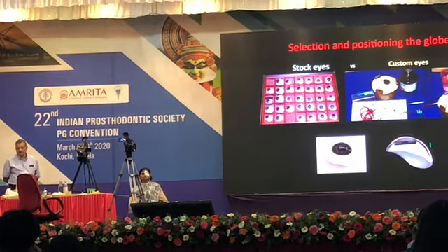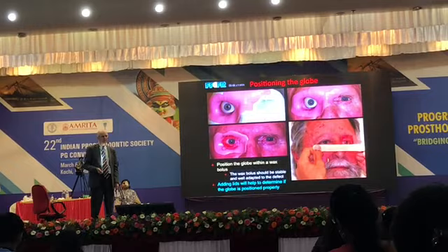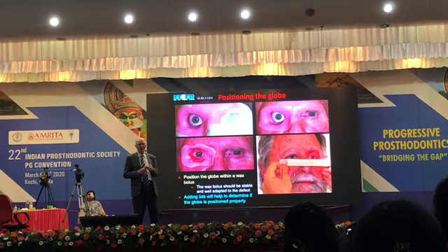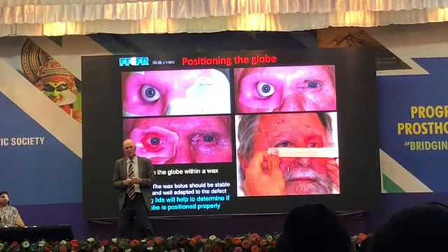Then what we do is we select a globe. This is a flashlight, one of these modern flashlights, so you stick it in somebody's eye and they close. So you need not a very prominent light source to do this, because the patient has to keep their eye open in a normal position while you're doing this. You cannot do this without a light source. It's the only way I know of to position the globe properly.